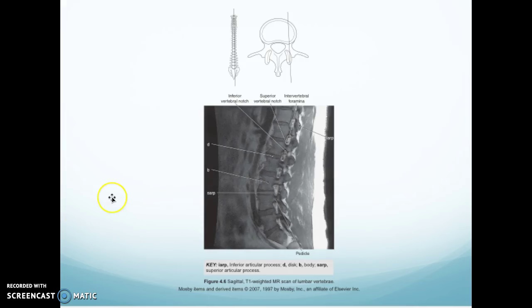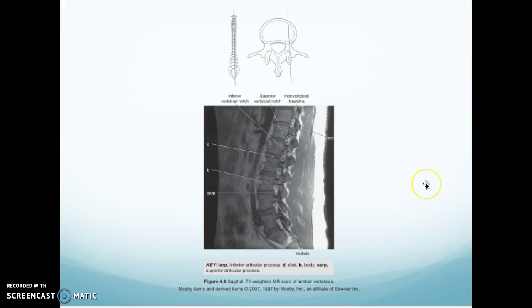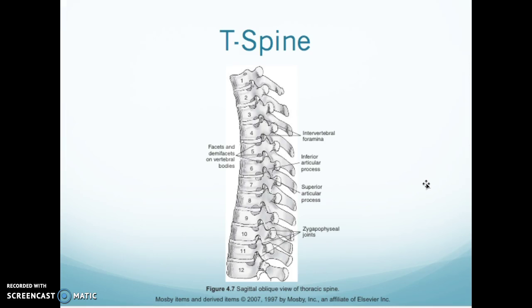This is an MRI T1 sagittal. We have your inferior vertebral notch, your superior vertebral notch, your intervertebral foramen, and your spinous processes in the back. You have your disc space with the body and your superior articular process there with your pedicle — you can see a piece of your pedicle there with your T-spine.